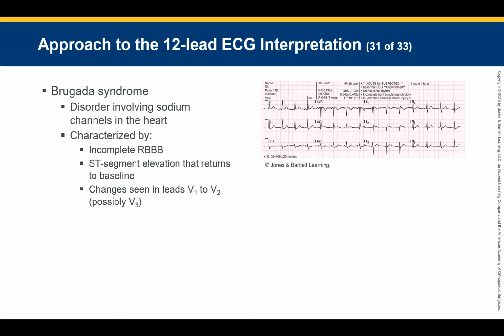Here's what I need to tell you about Brugada. It's a thing. So if you see the word Brugada on a test, it's a thing. Treat it just like a STEMI. And then the doctors can tell you you're stupid later. That's not considered a STEMI, I wouldn't even put it up there, because I cannot tell the difference in the field versus it being a STEMI. So I'm going to treat it like a STEMI. I'm going to activate a STEMI, and then if it goes back to normal, the doctor later can be like, "Oh, that one's Brugada." Okay.